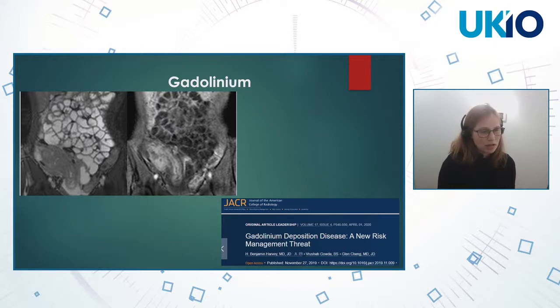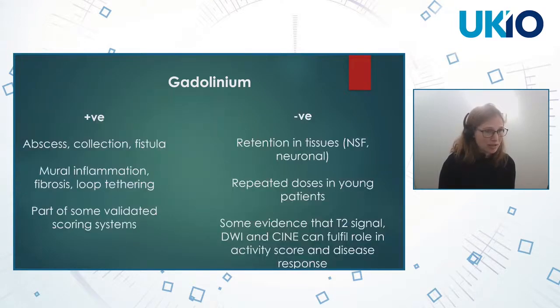And of course, these are young patients who are coming back repeatedly throughout the year for multiple studies for probably the rest of their lives. So if anyone is going to get problems from gadolinium deposition, it's probably this cohort of patients.